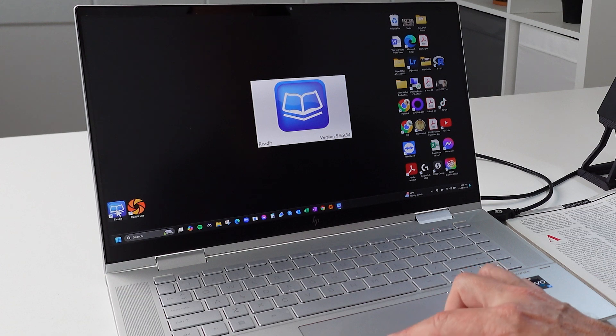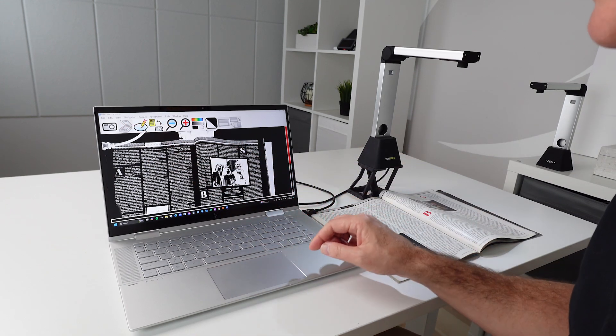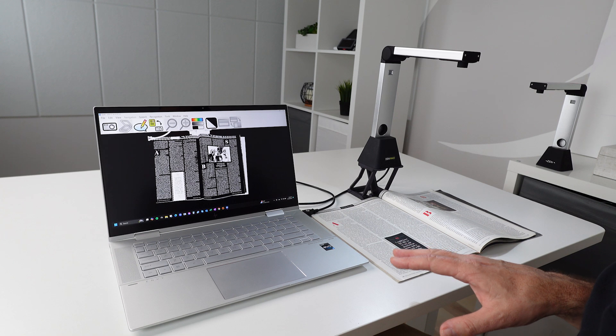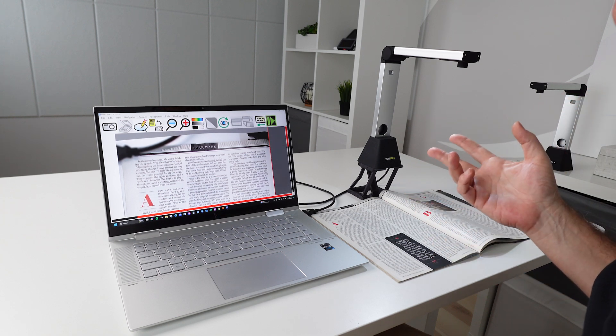To get started, we open up the Read It software on the Windows computer. Read It is now ready. We have a pretty old, beat-up computer here — similar to what you might have. I can hit the little camera icon or press Enter to scan. Capturing — it waits a second to make sure nothing's moving. Recognizing. One thousand, two, one thousand. 'In the screening room, Abrams is finishing his speech.' Not bad — around two seconds on this kind of old computer. So it does what it says.